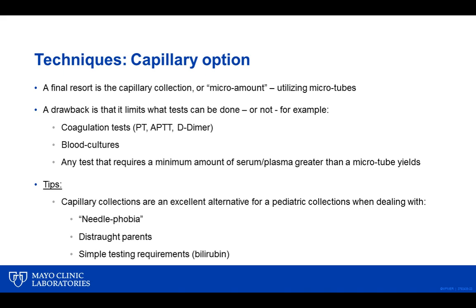But we do want to mention capillary options as another possibility in that difficult patient, especially if it's for a single test, like a metabolic panel, a bilirubin, something with serum. Those seem to be the most test-friendly analytes for dermal punctures or capillary punctures.